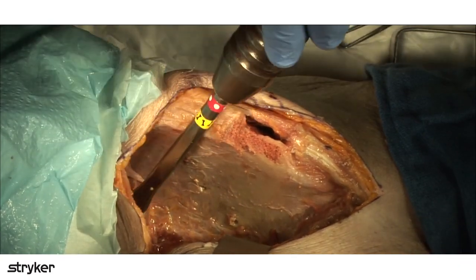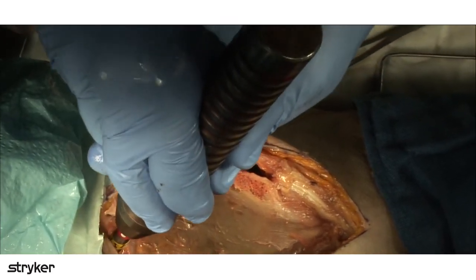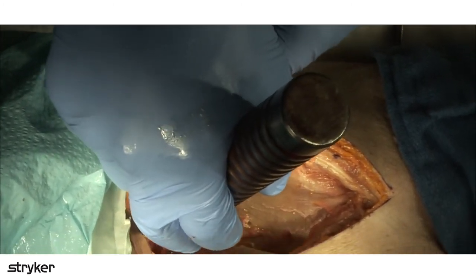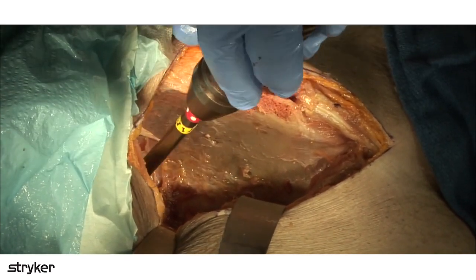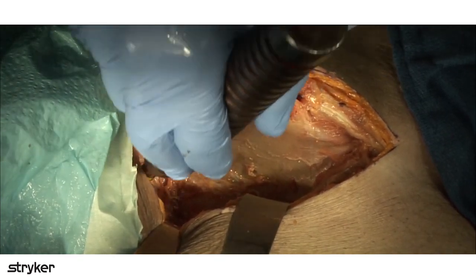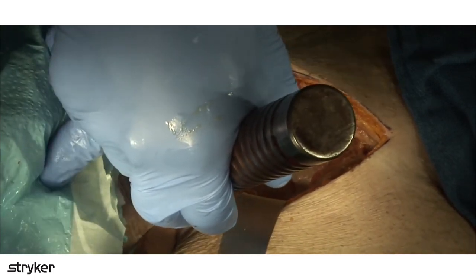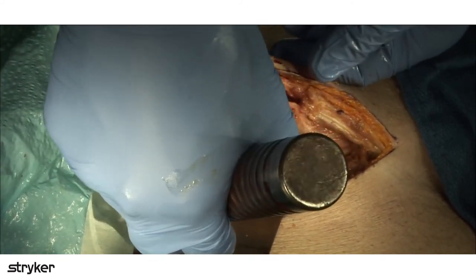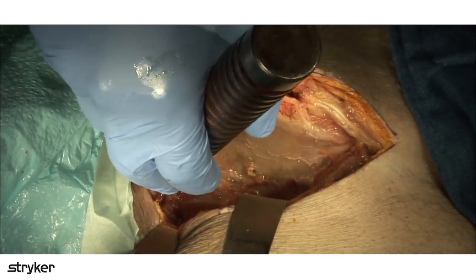There's another position here. You can park a blunt Homan or a Cobra type clamp up over the very cephalad and medial aspect of the iliac wing that can help get you to some of those very small crescent type fractures or very proximal medial iliac wing fractures that are part of a both columns fracture pattern. You can slide a clamp over there to get better access for reduction and putting a plate across. That's often a very difficult place to get, but I think this facilitates getting you there as well, just because it detensions all that soft tissue attachment.